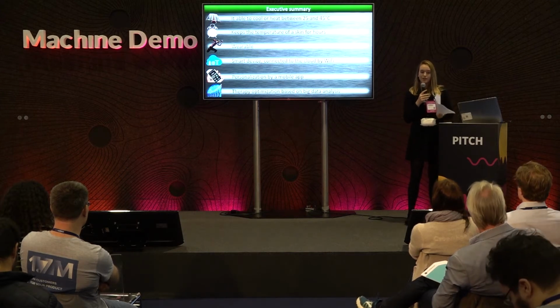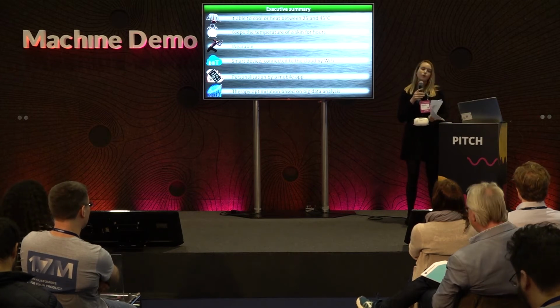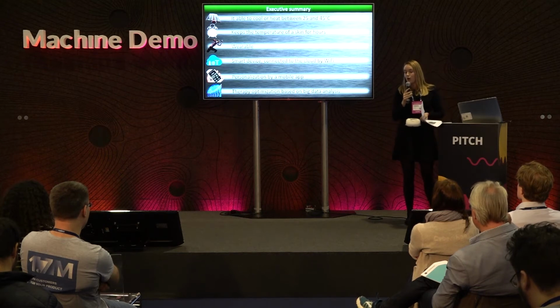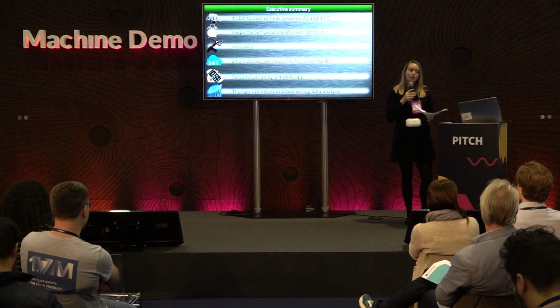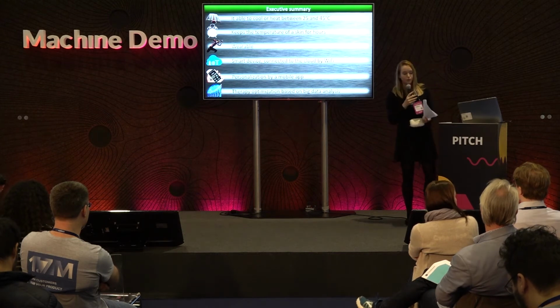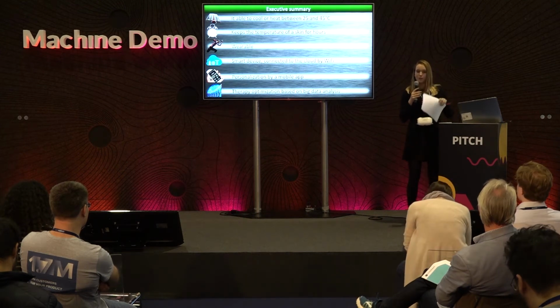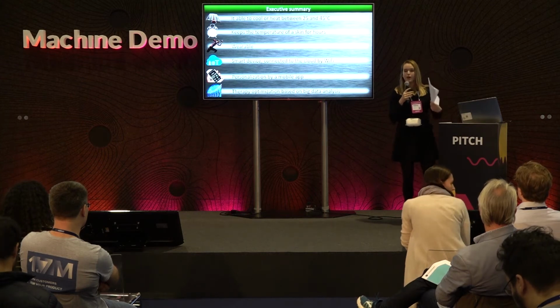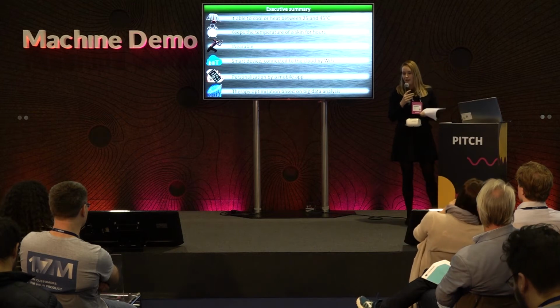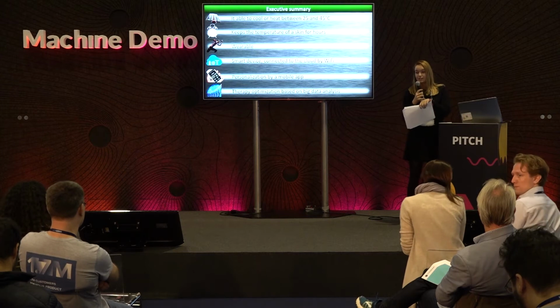There's a small device that should be connected to communicate with this device. The most optimal one was the smartphone, and therefore you can also operate the temperature and the kind of therapy you should use, and you can always change your parameters. For example, if you want to personalize the therapy, you always need to check your parameters like your height and your weight, and that determines your skin conductivity.